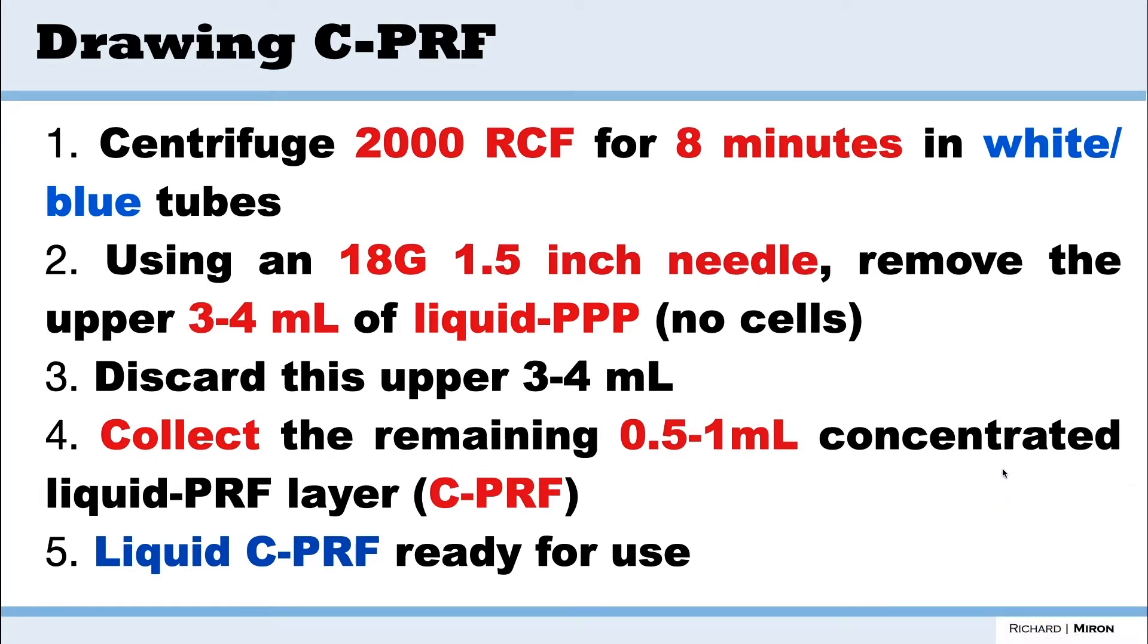Now, a small little trick that we're going to go over here. When you use the 18 gauge needle, the best thing you can do is instead of like in the previous video where we used to take the needles and the syringe and go all the way down and try and take out a little bit of that C-PRF layer, what we call it, it's very challenging to do that. And this technique here that I'm showing is much more effective and I'll explain why in the video.